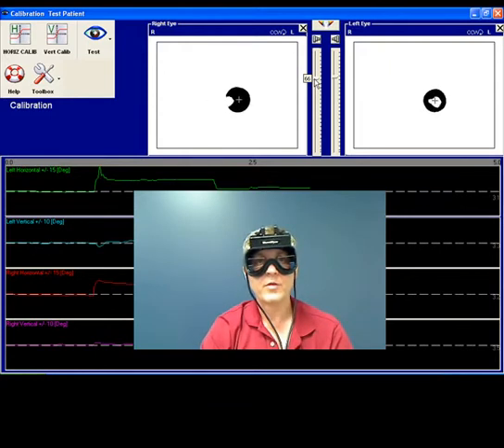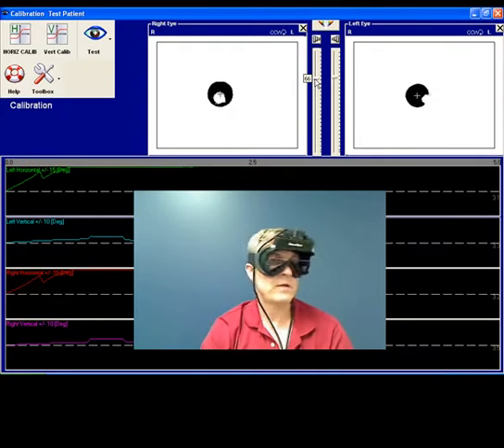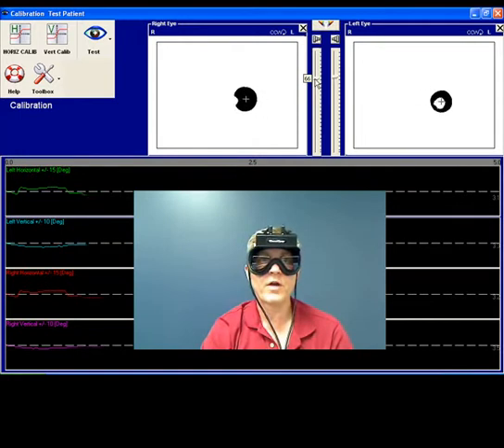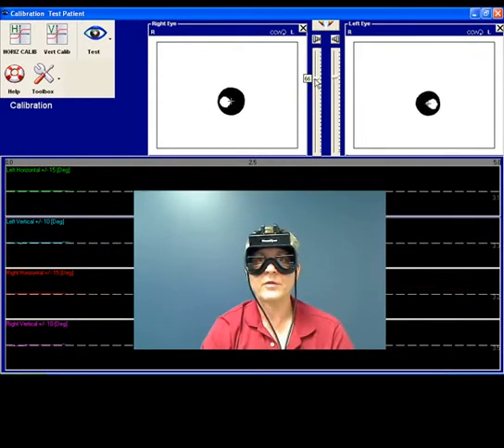In this case, I'm going to move my head — left, then right, then down, and up — and you want to make sure the crosshairs stay on the pupil. When that is satisfactory, you can move on to calibration.